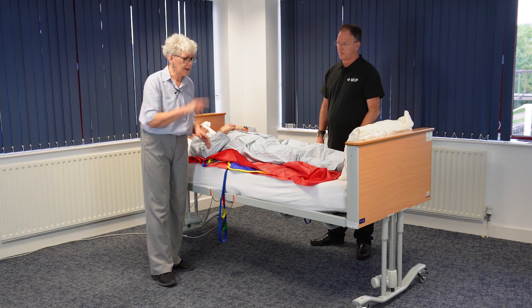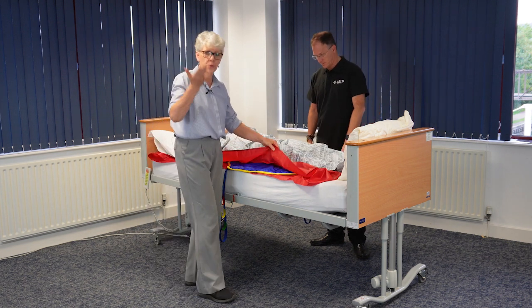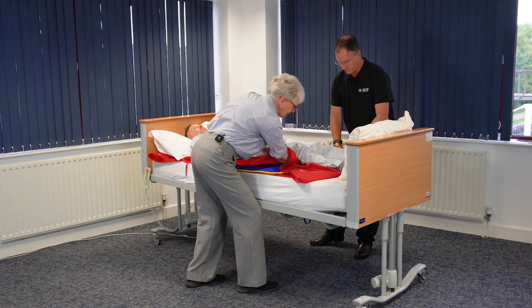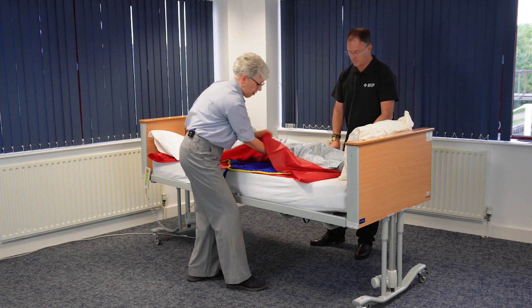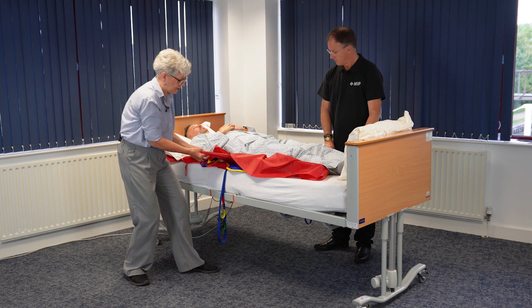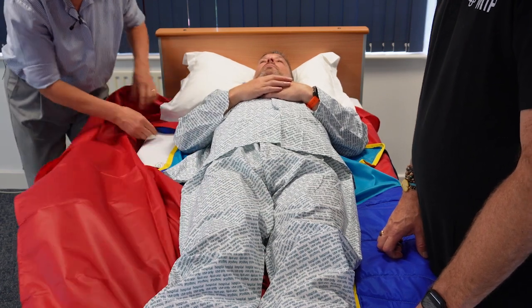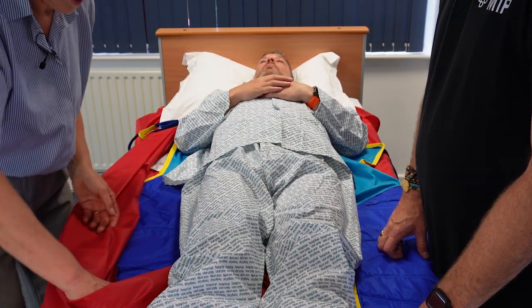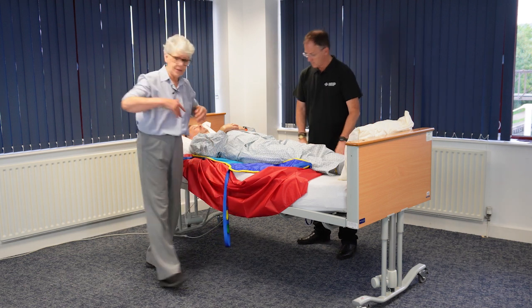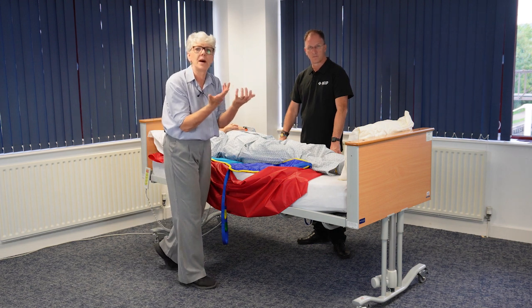Having positioned my sling, I now need to take the top layer of the slide sheet away. To do that, I'm going to bring my hand between the two layers of the slide sheet and grab the top layer, and fold it back on itself but on top of the sling. I'm just pulling on a diagonal and bringing that top layer out to expose the sling. I can just untangle that, make sure that the sling is out — and that's as much as I need to take out. At this point the sling is ready to be positioned under the legs.